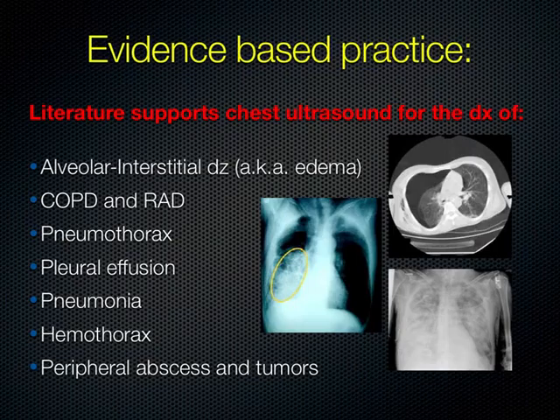So looking at the evidence, there is a great deal of evidence supporting the use of chest ultrasound for the diagnosis of many conditions, including pneumothorax, pneumonia, ARDS.